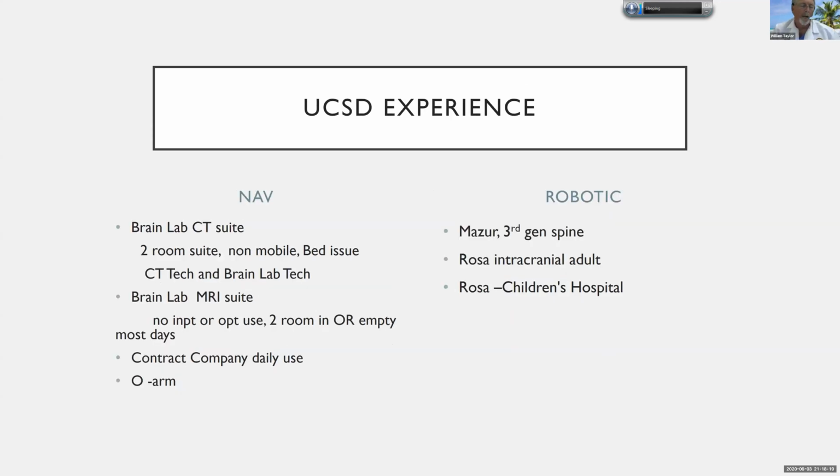So what happened to us here at UCSD? That's really the only useful information I think I can share with people, especially since someone asked the question about what robot we should buy, essentially, or when we need one. And here's what we have done.